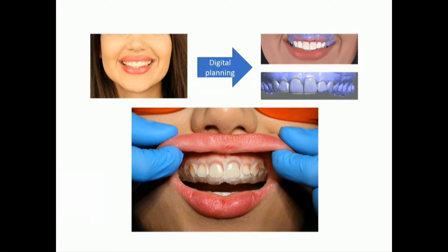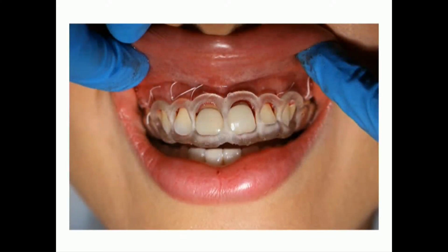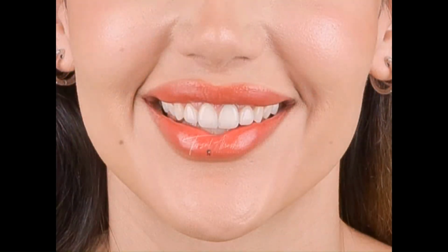And this was done, I think, 2 years ago. And Dr. Mahdi kindly did the crown lengthening. He followed my surgical guide. Thank you so much. And then after that, final prosthesis. Copy, paste. Thank you.